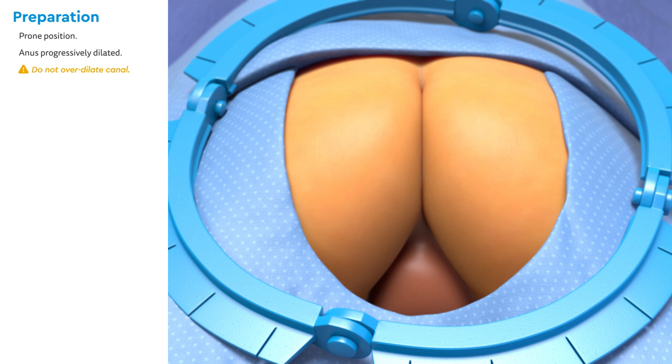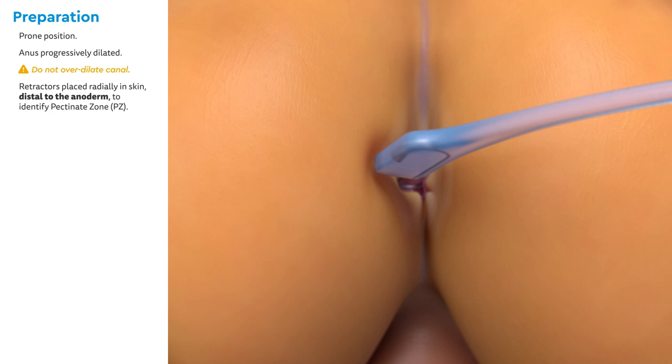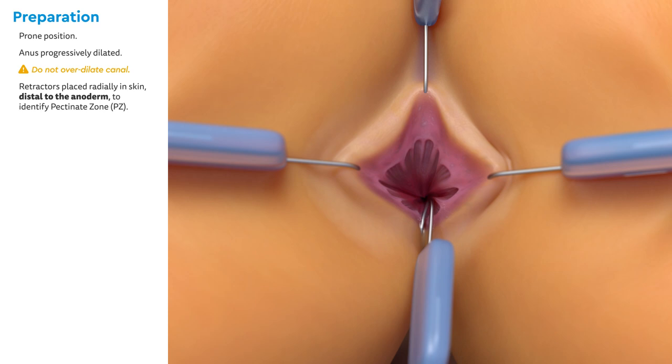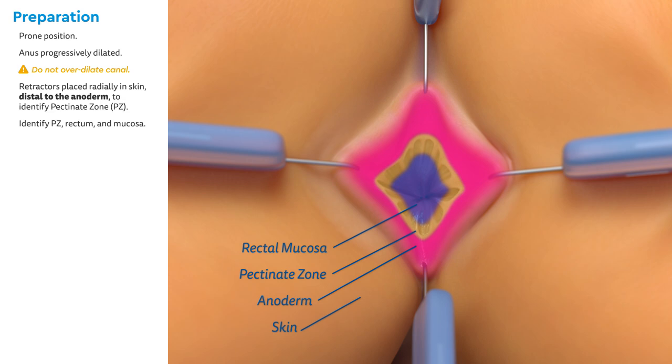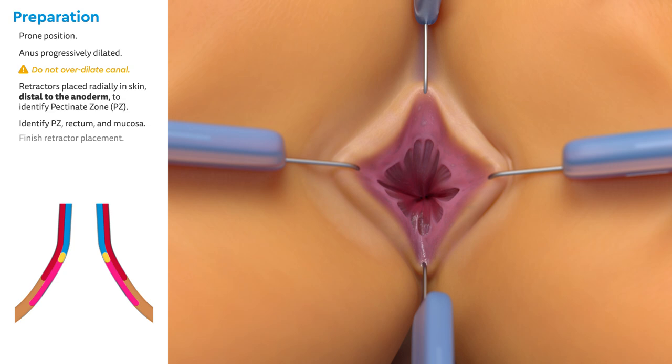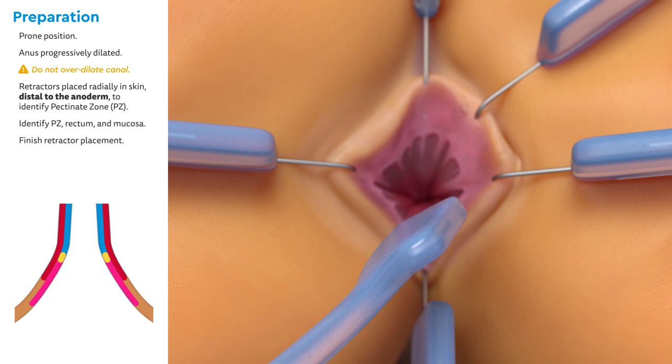Next, the pectinate zone must be identified. Retractors are placed radially in the skin distal to the anoderm. Identify the anoderm, the pectinate zone, and the rectal mucosa before proceeding. Adjust the retractors as needed and finish retractor placement.